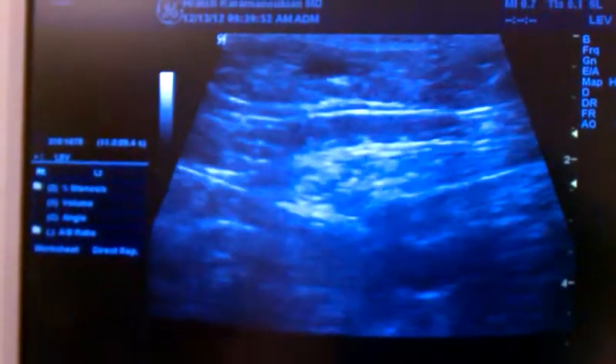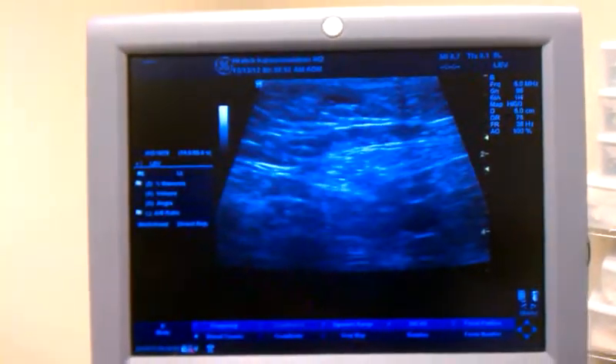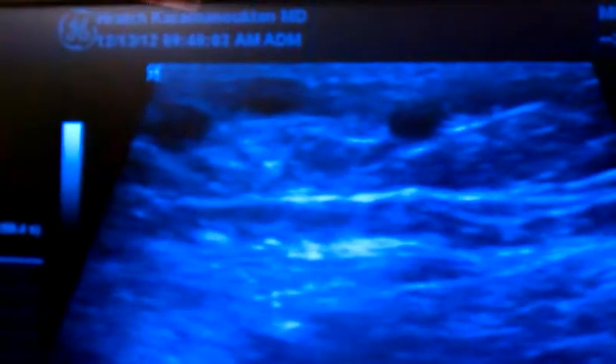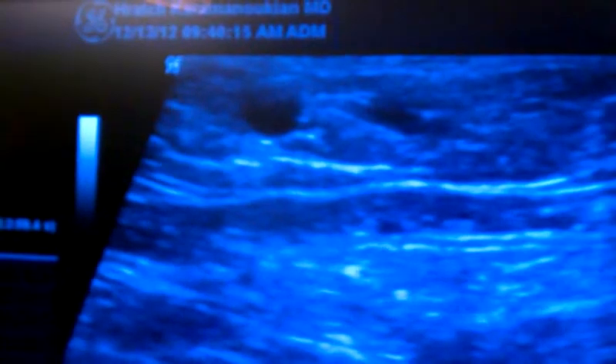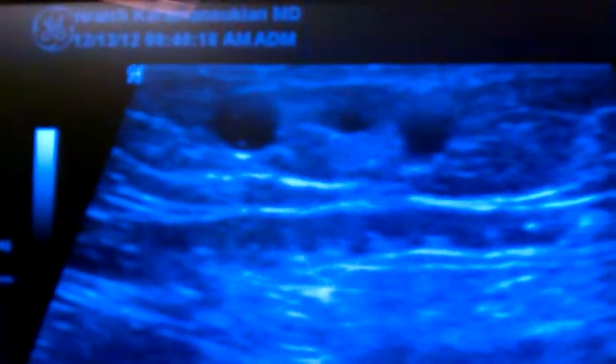So we're going to inject these. You can focus here on the thigh, or you can stay on the video there. You'll see the needle go in, and I will show it to you. See the tip of the needle? And then you'll see that haziness — it'll go into the varicose vein. I'm going to go here in the middle of the screen again. You'll see the needle come in, the tip of the needle.